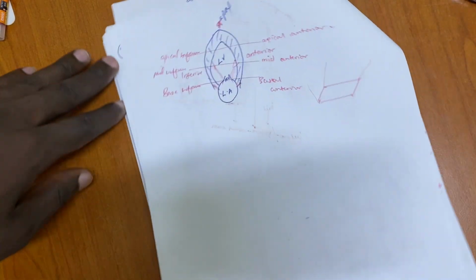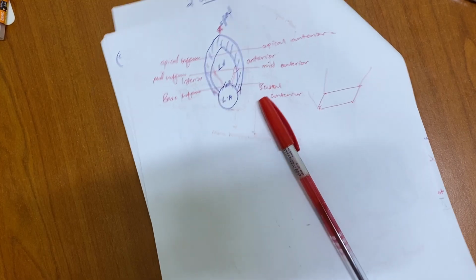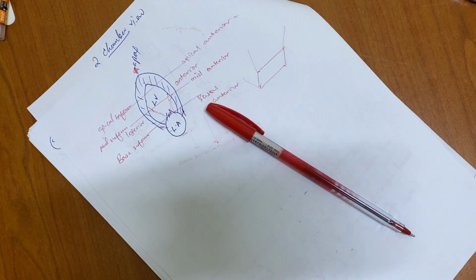So far we have seen the 17 segment model from the short axis, then long axis, and then the apical views. There's another one, the 3-chamber view. We may not see it, but I'll be showing you when I do it.